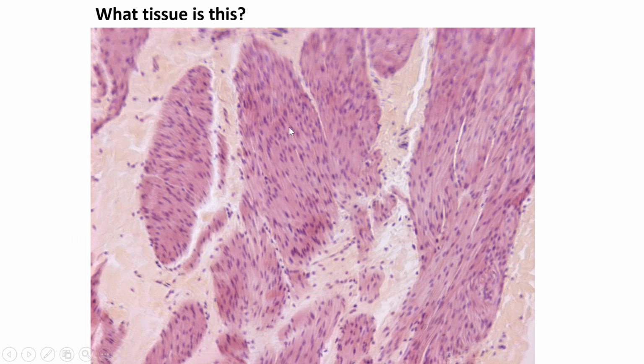And finally, the question is, what tissue is this versus what tissue is this? Again, this is smooth muscle. And the collagen now is more of a less pink. So with the different subtleties in the staining, you can actually nicely tell smooth muscle from connective tissue.